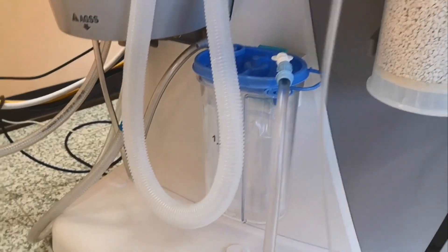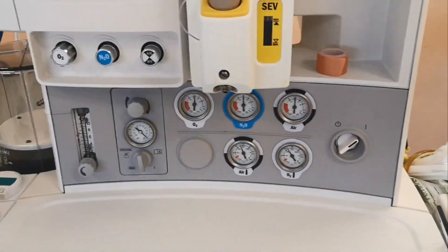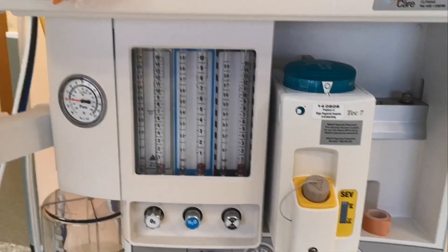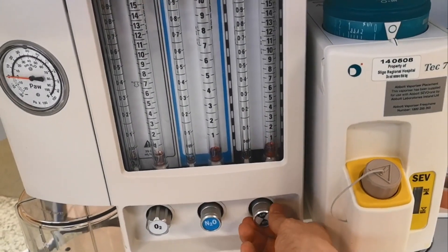Same as usual. The switch is here. And those are the flow meters — oxygen and air.